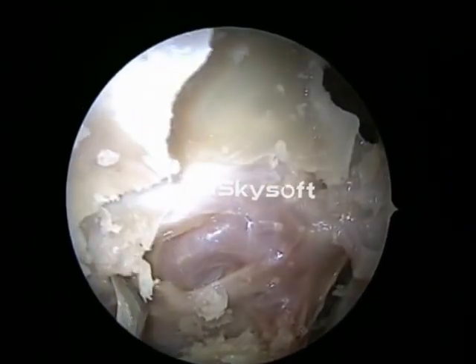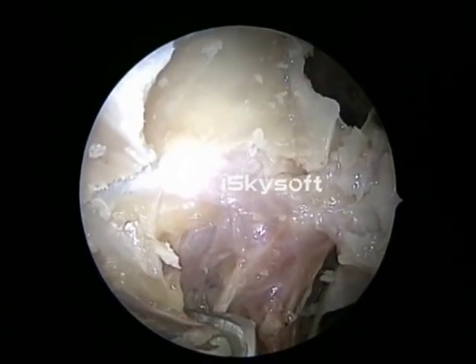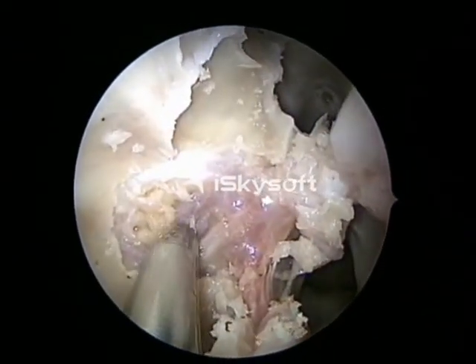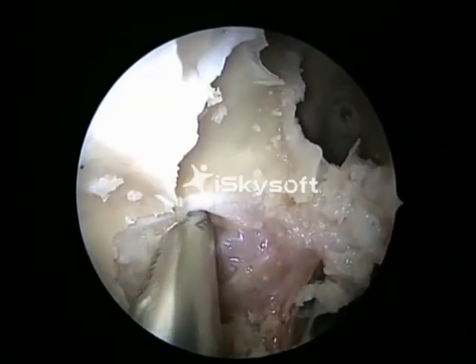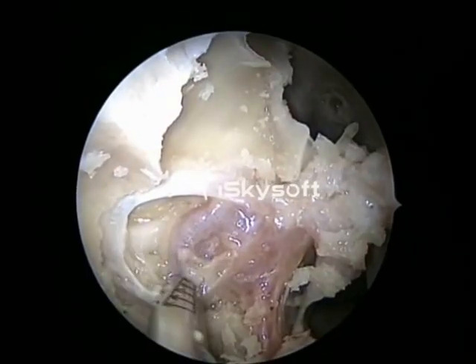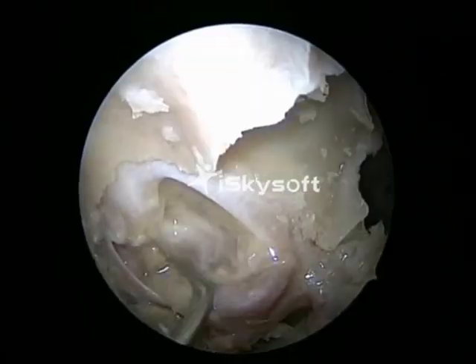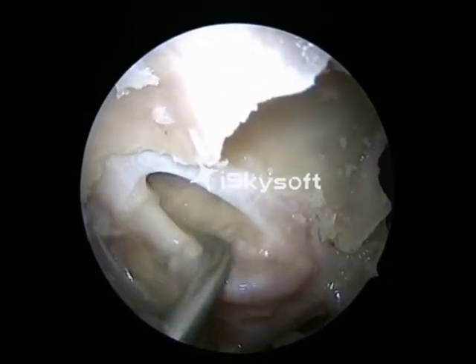That's the internal maxillary artery being delineated very clearly in your picture. That's a pad of fat being slowly separated. We are now using a debrider to tease out the fat, and now we'll have a glimpse of the maxillary nerve, which continues as an infraorbital nerve. That's the maxillary nerve coming out of the foramen rotundum.